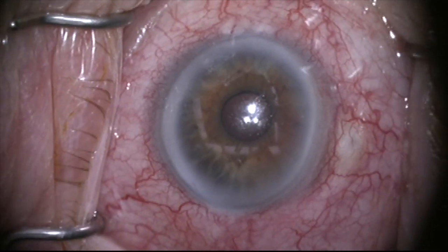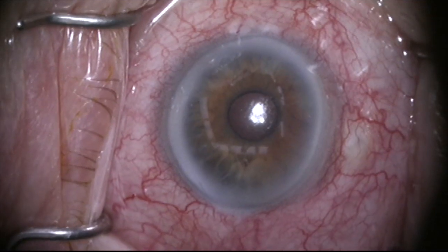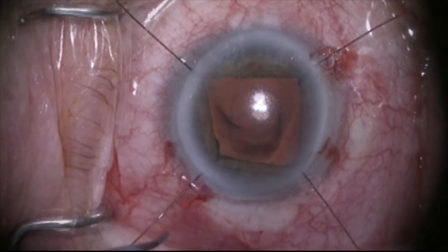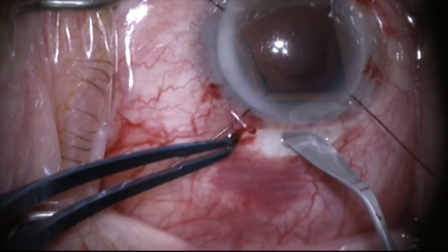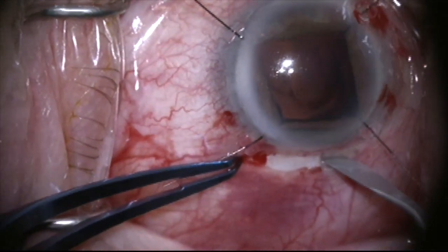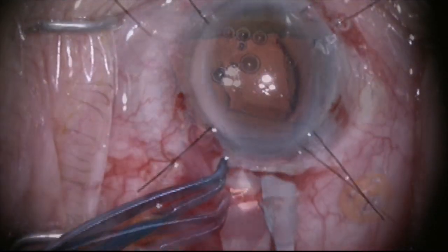This is a patient referred with chronic cystoid macular edema and inflammation. He has a filtering bleb at 12 o'clock and the pupil does not dilate well. There is a dislocated lens capsular bag complex in the back of the eye, and we're going to try to exchange that for a scleral fixated lens.